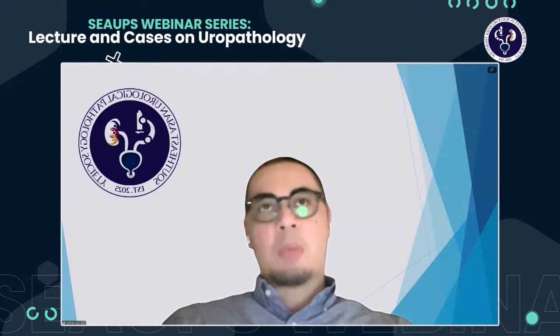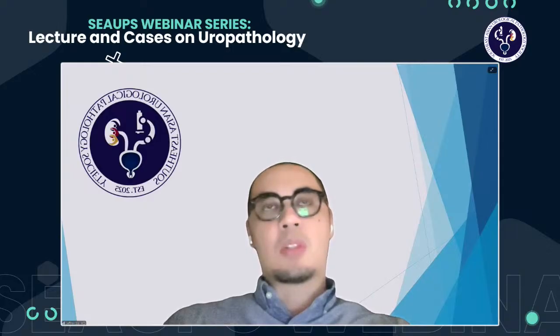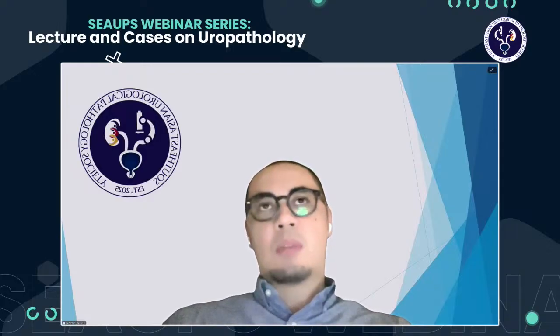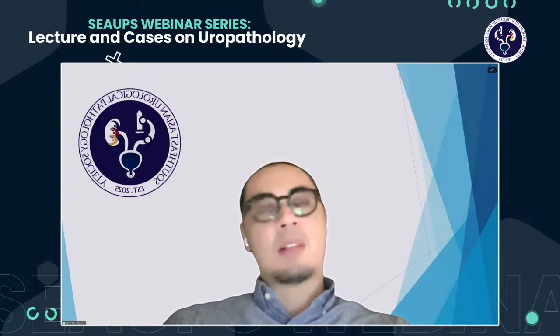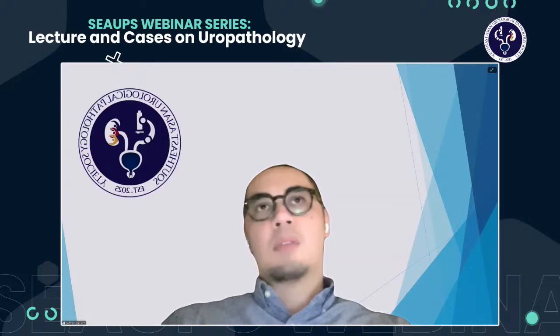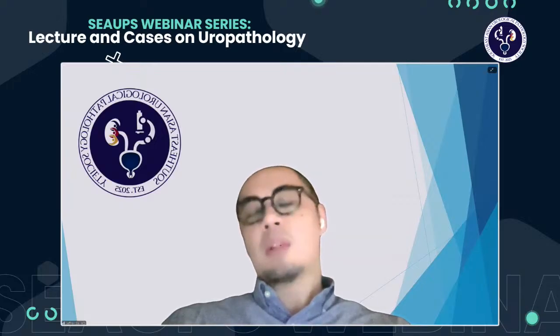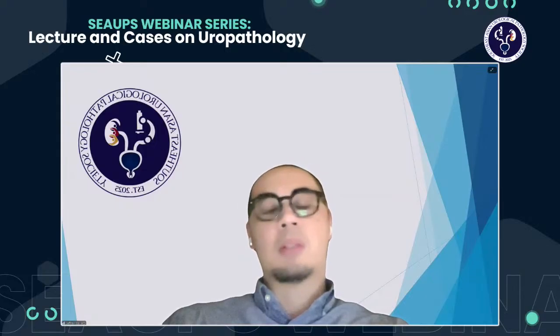Your lecture is pretty good and reminds us, in relation to the first question, that sometimes you unavoidably have to do stains, especially when you have those types of cells. I would still try to rule out prostate cancer when they're too pleomorphic. I would do CK at the very least, which you did. And then, as you said, if all the other stains are negative for any carcinoma, I would tend to favor a STUMP, especially if you don't have necrosis or any unusual mitotic activity.